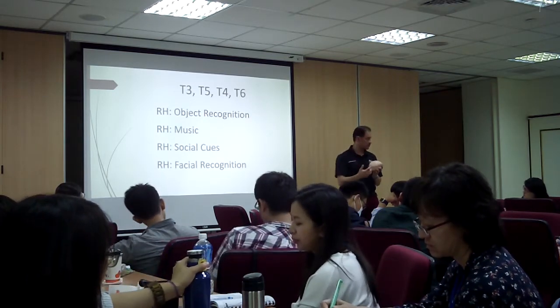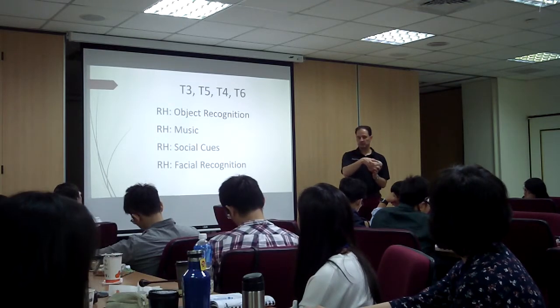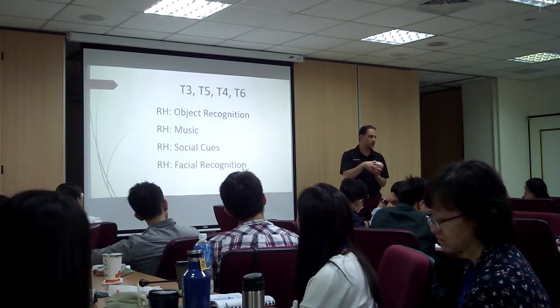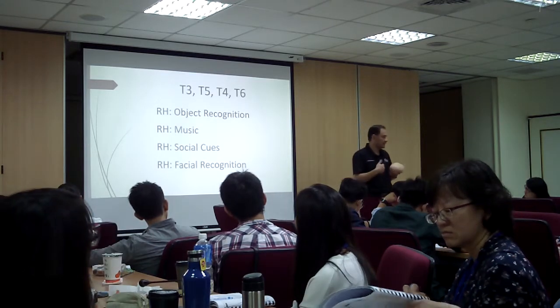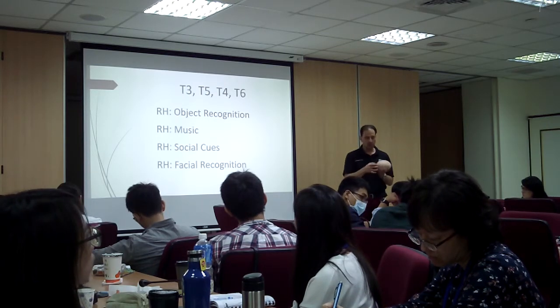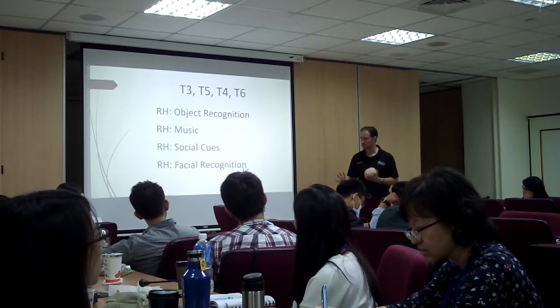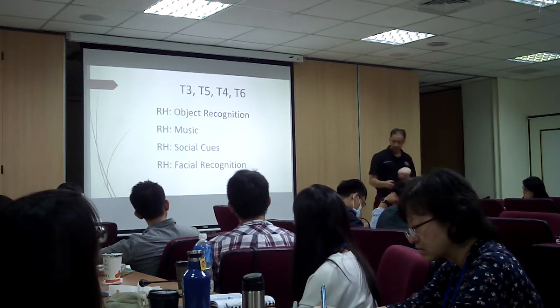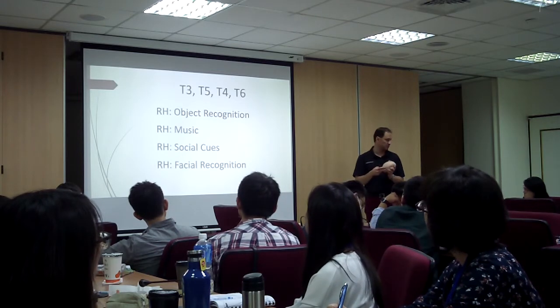inhibition, behavioral inhibition, Cz to T6 is a good program. And that's the kind of kid who will do it just to get a rise out of the teacher, because he's the class clown. So the kids reinforce that, they'll do it. But if you want him to control their behavior, that's important. Cz to T6 for behavioral inhibition. And social cues too. A lot of people who have problems socializing, Cz to T6 is a good spot too.